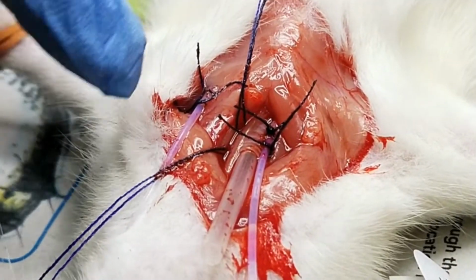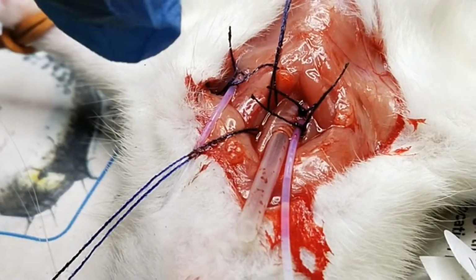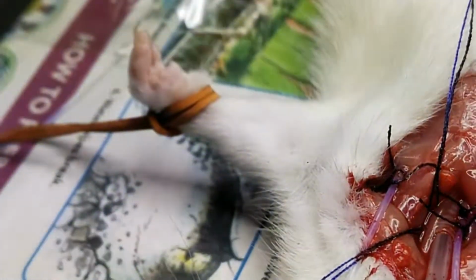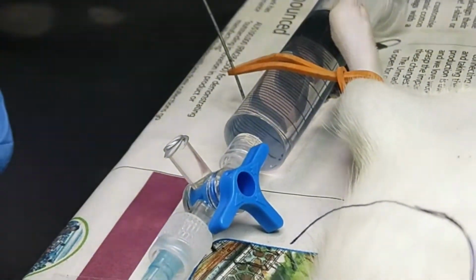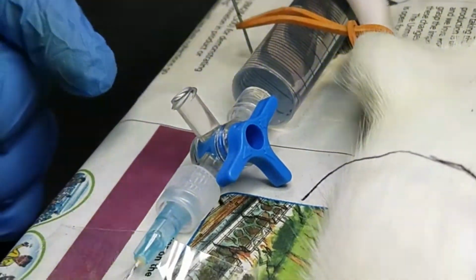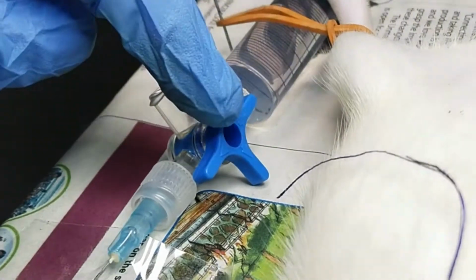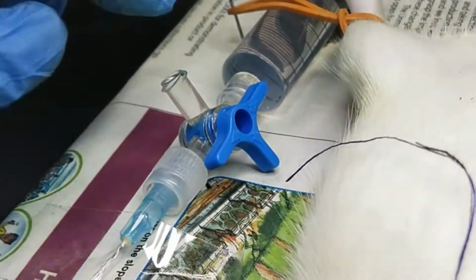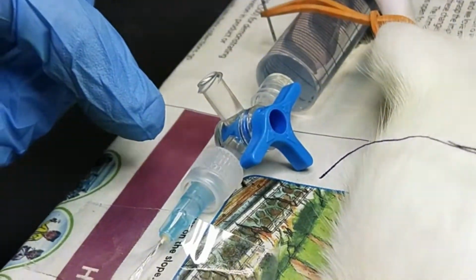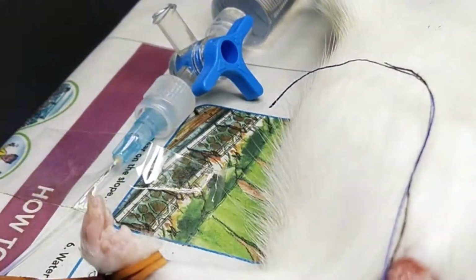We have already done the cannulation for the jugular vein, and it will be connected directly to the tube and to the syringe here. Inside the syringe we have normal saline. We also need to inject the drugs using the syringe. We have a T-valve, and we are going to introduce the drug inside the syringe and see the effect of certain types of drugs on the blood pressure.